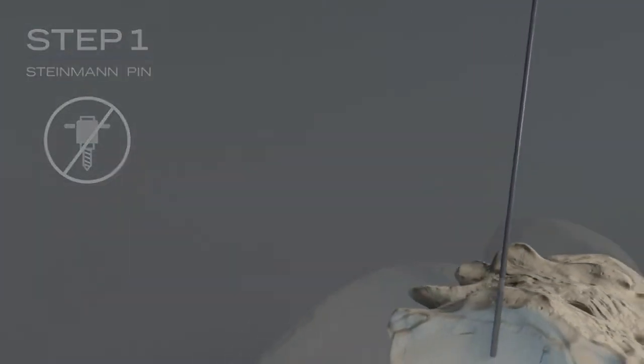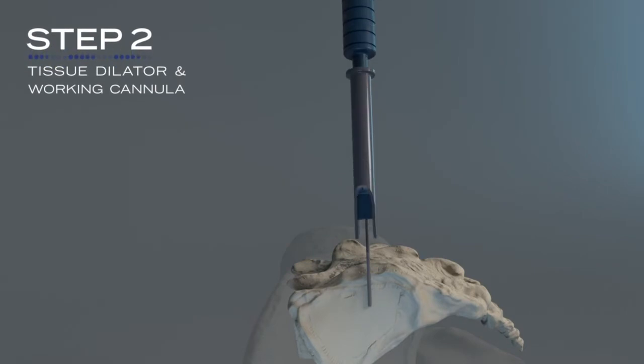Next, the tissue dilator and working cannula are inserted, creating separation in the joint.